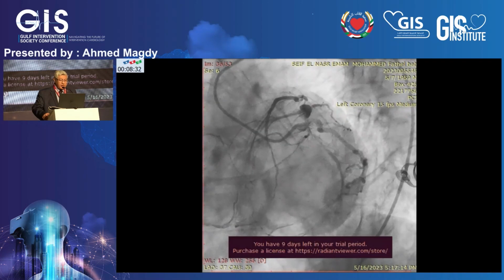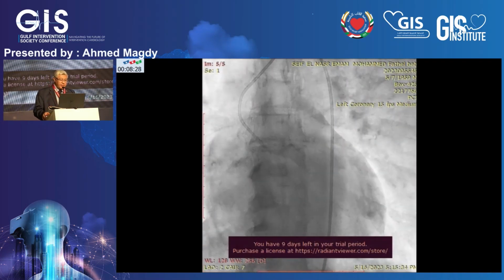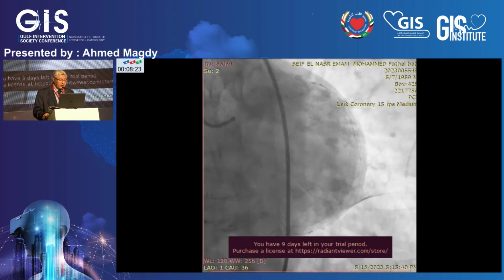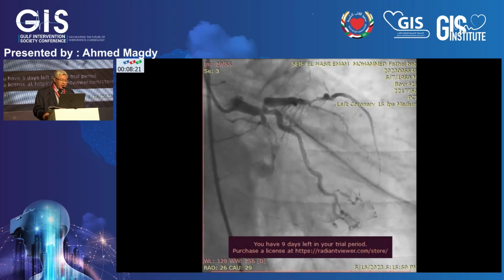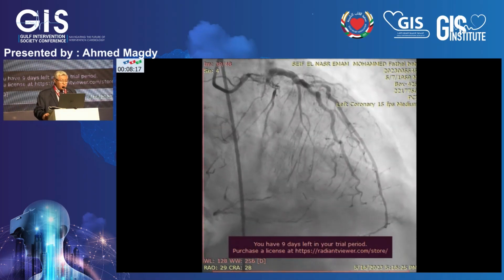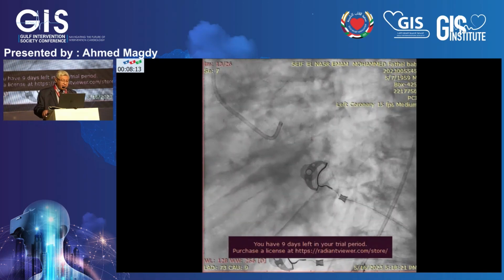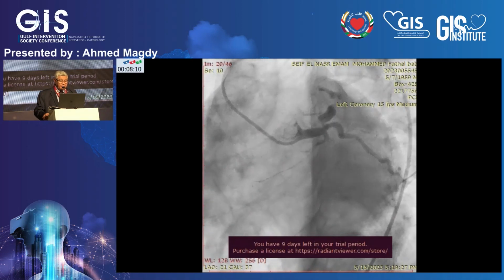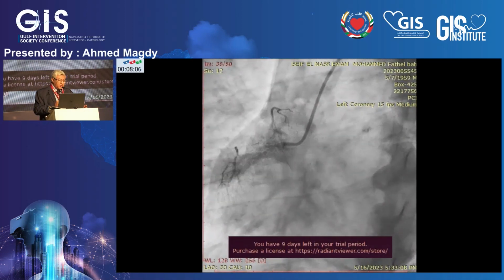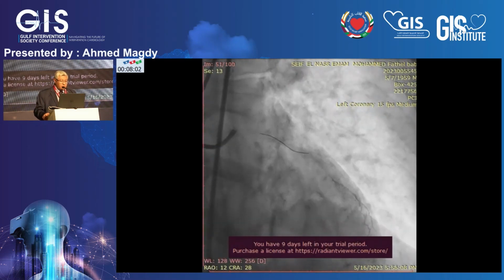So this is another patient, he's 65, acute anterior infarction. The difficulty of it is pinpoint obstruction in the ostium of the LAD, and the left main and the LAD are huge, and so the wiring is difficult. Then you need to do double wiring, double care for the wire to reach this lesion. I didn't consider surgery because of the acute infarction and because of his age. So wiring was difficult, but we did it.